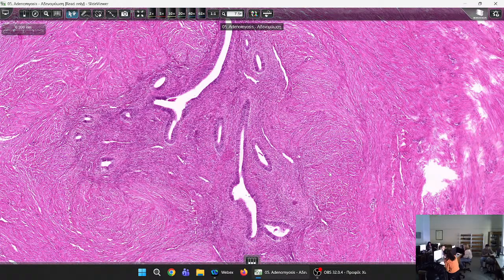And if this affects the salpinx, then they will become stenotic. And that can be a cause of infertility. So how is this called? The presence of endometrial tissue, but not in the wall of the uterus, not adenomyosis as here, but outside the uterus. How is this called?